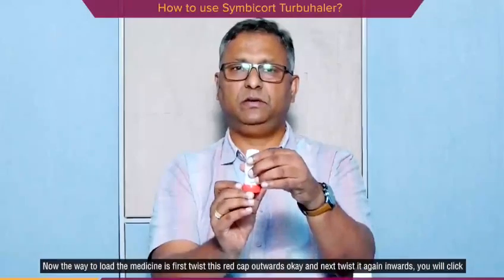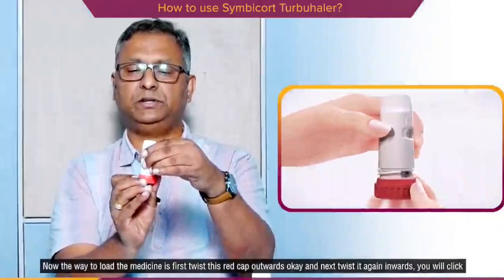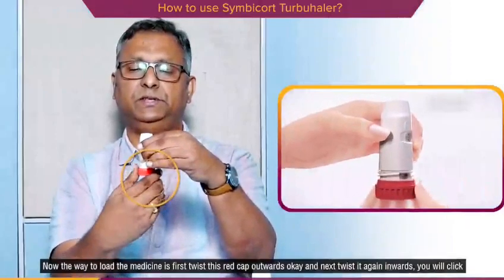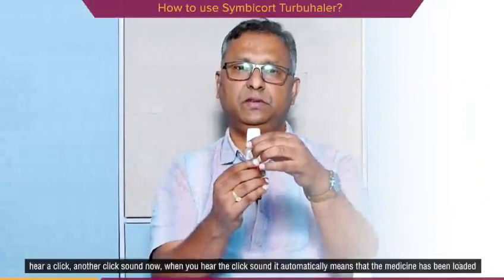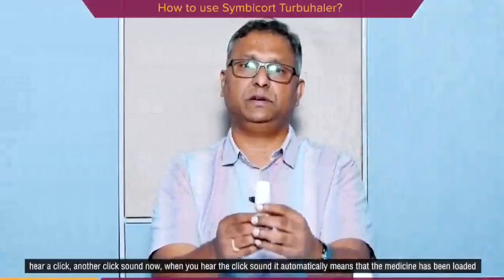Now the way to load the medicine is, first, twist this red cap outwards. Okay. And next, twist it again inwards. You'll hear another click sound now. When you hear the click sound, it automatically means that the medicine has been loaded.